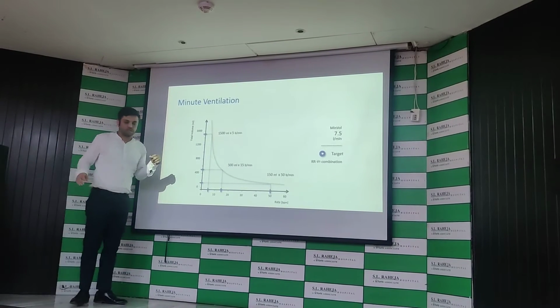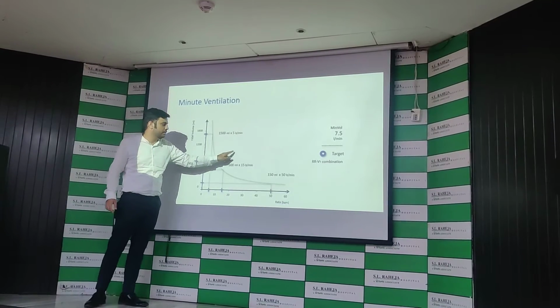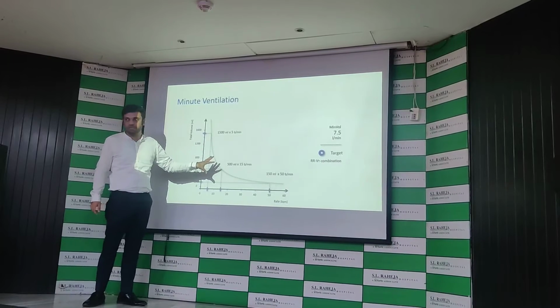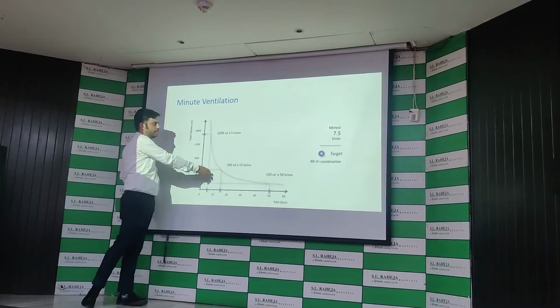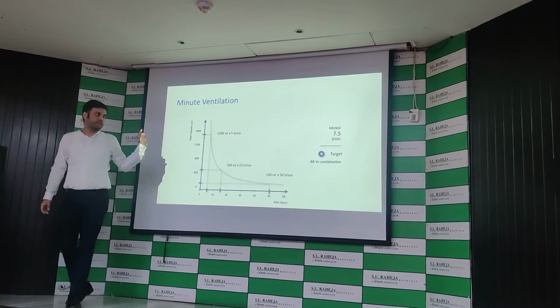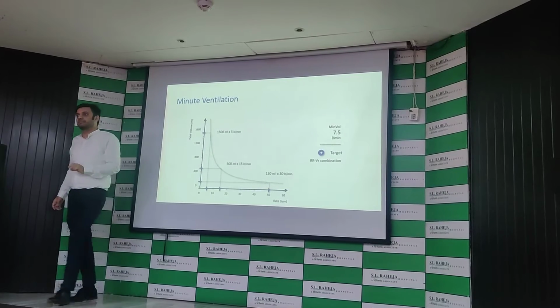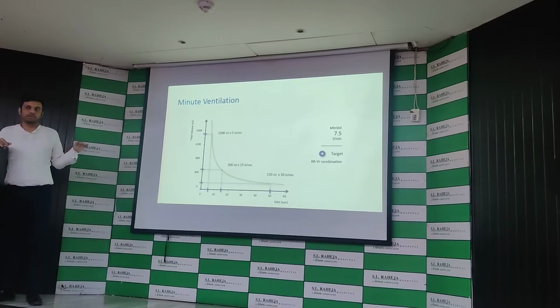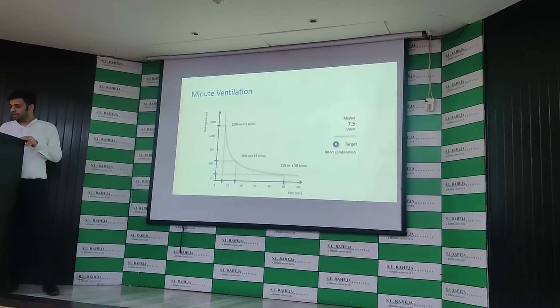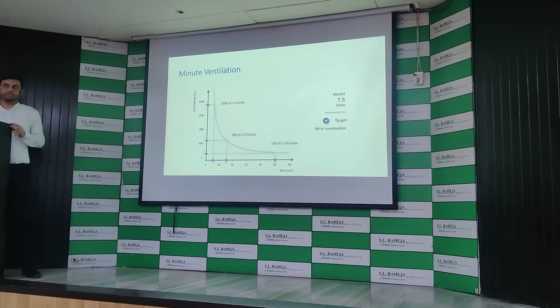Usually, what Ramesh also explained is regarding the safety square. If the safety square lies in the middle in square form, that means we are in the safer zone. If it is a rectangular vertical form, then it is for the obstructive. If it is a rectangular horizontal form, then it represents the restrictive part, so automatically the volumes will be delivered less with a high respiratory rate. It is calculating the safety zone by looking at the tidal volumes and the pressure.